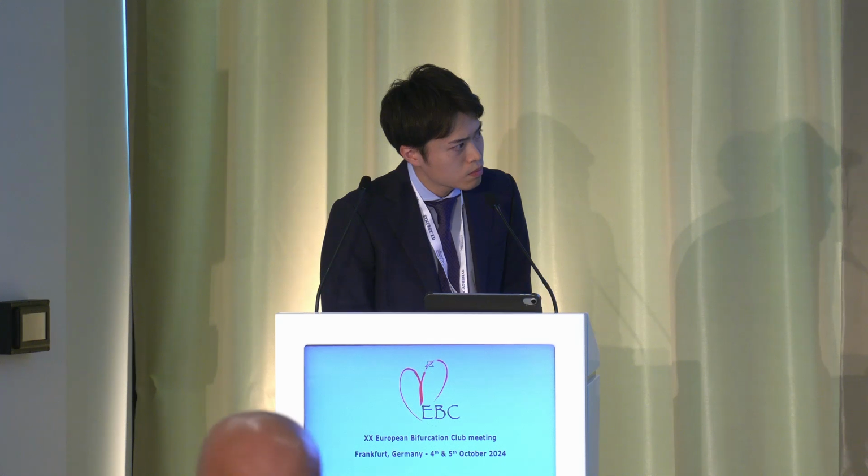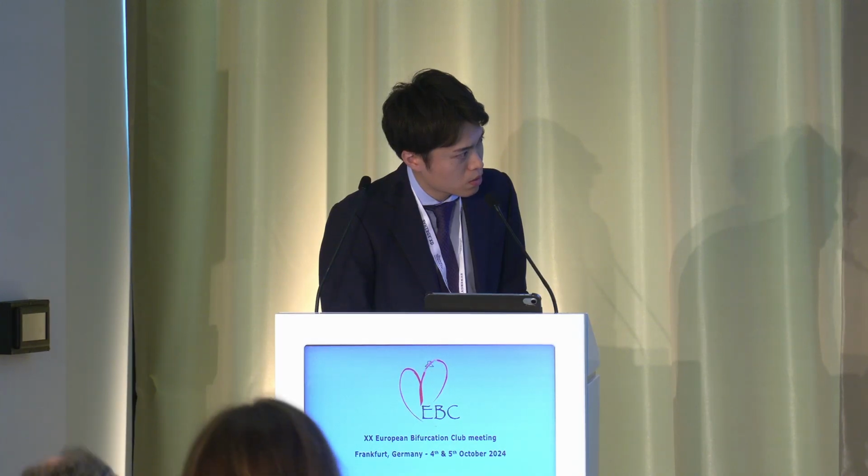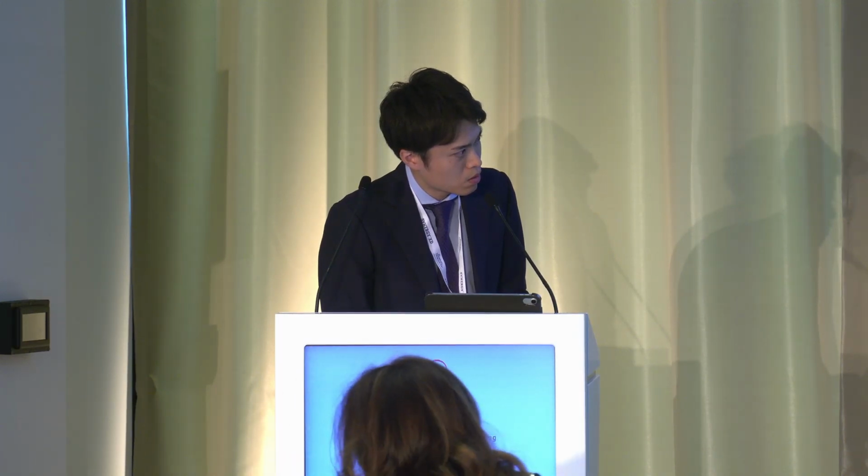What diameter of the side branch did you take? The lumen diameter or the external elastic diameter? What's the diameter of the side branch you have taken? Is it the lumen diameter or the median diameter? You mean side branch stent diameter? Is it lumen diameter or the EEM diameter? It was a lumen measurement, wasn't it? Of the three metrics, the side branch diameter was lumen edge to lumen edge, right? Not EEM to EEM.